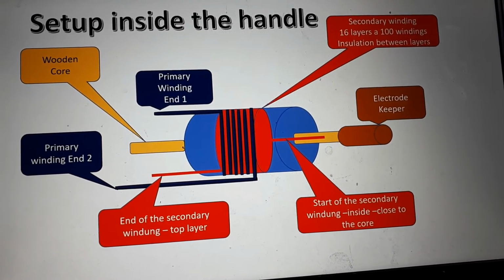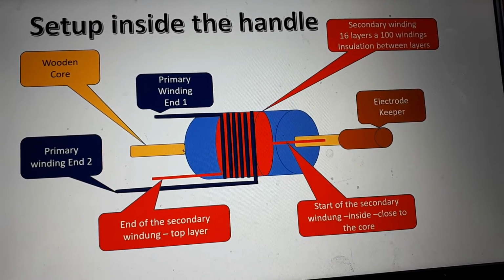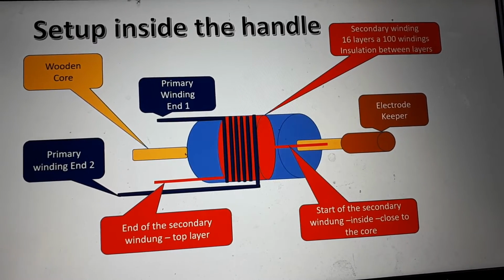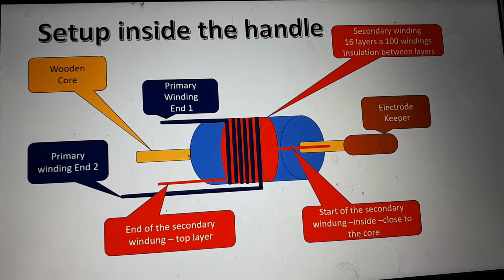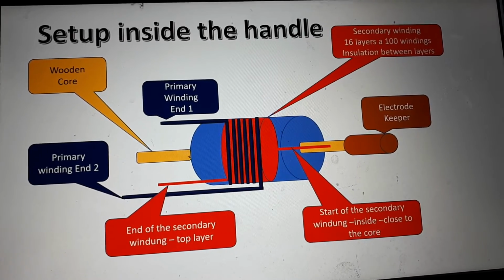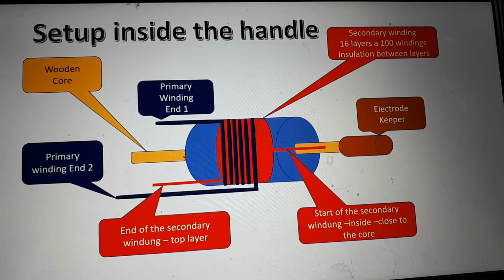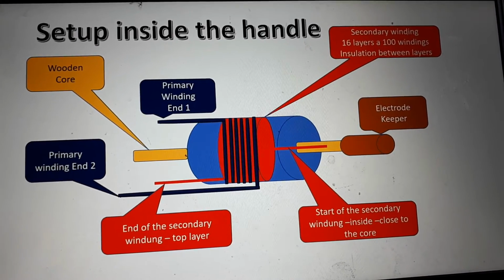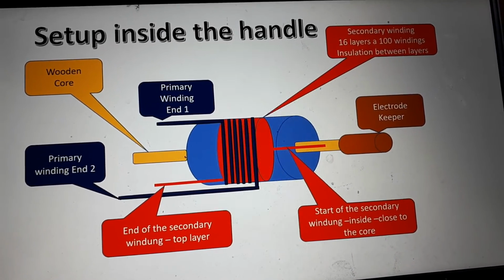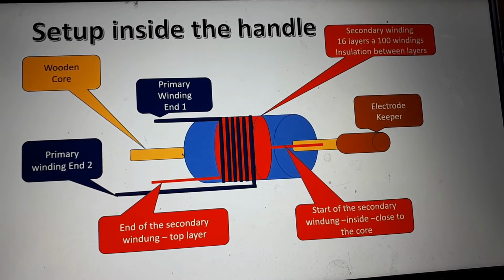So you check the coils for some metal parts. Normally there is a metal part at the end of this coil that is connecting the coil with the electrode keeper, and this is your second point for measuring the secondary coil. So you check those both ends of the secondary coil. You check if there is an energy throughput or not. If there is an interruption in between, your Tesla coil will not work.